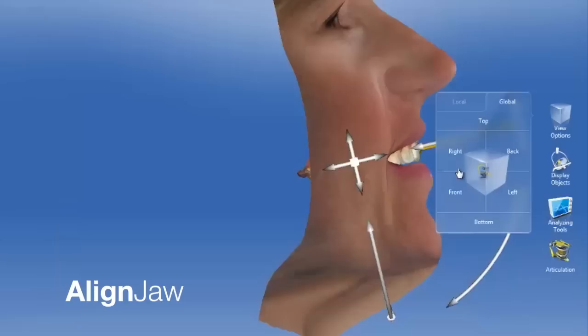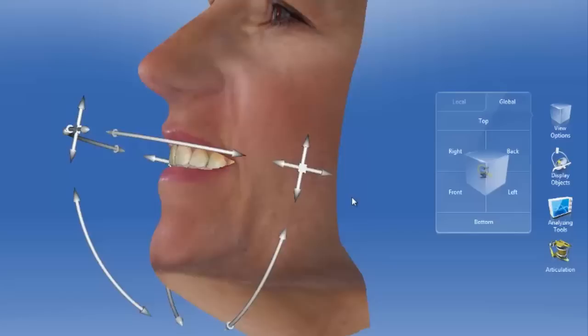We can check from the front and also from left and right to make sure the anterior-posterior position is correct for the patient.